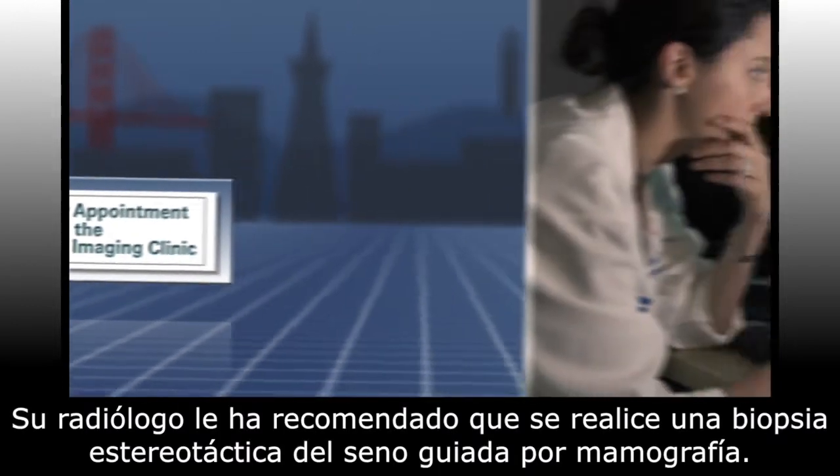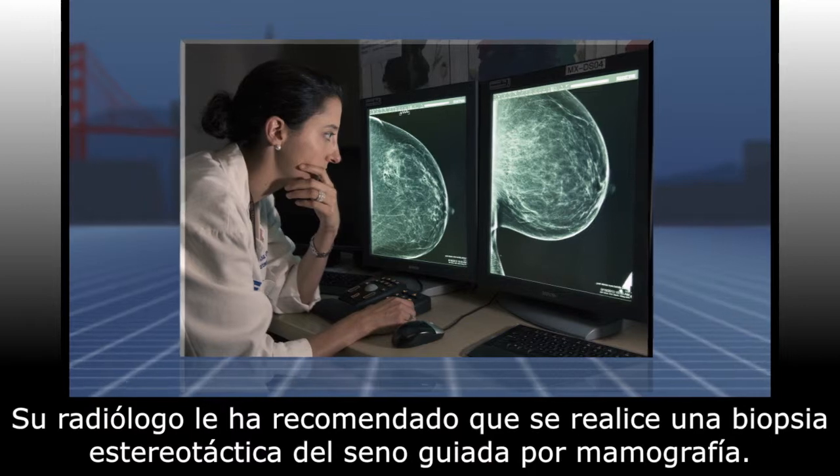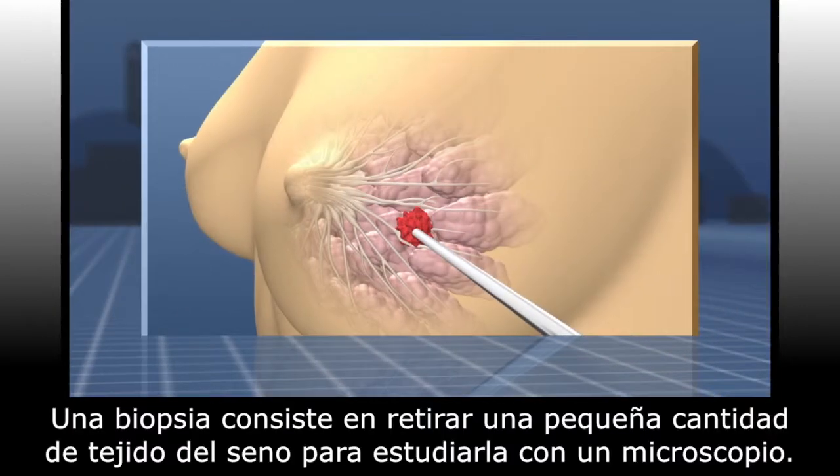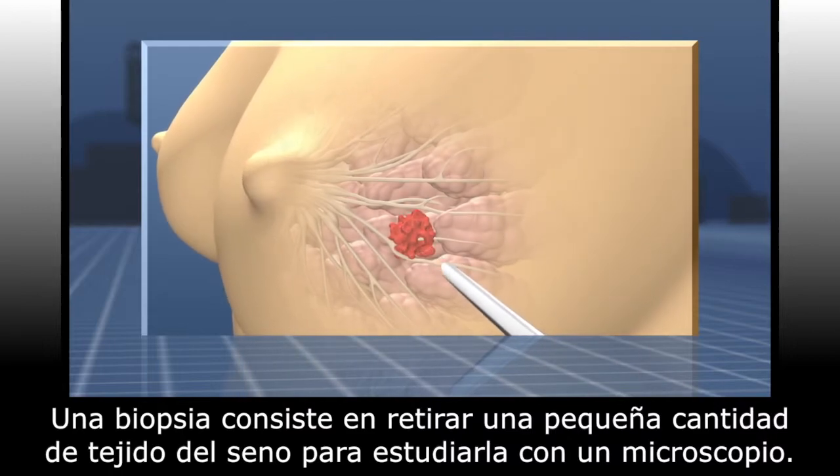Your radiologist has recommended that you undergo a mammogram guided stereotactic breast biopsy. A biopsy is when a small amount of tissue is removed from the breast to be studied under the microscope.